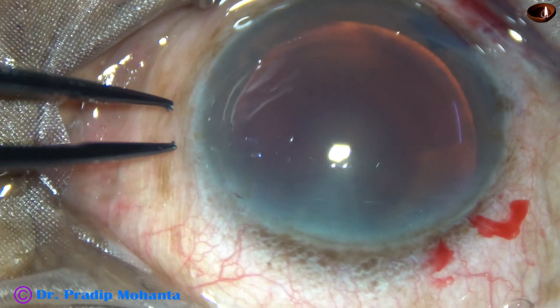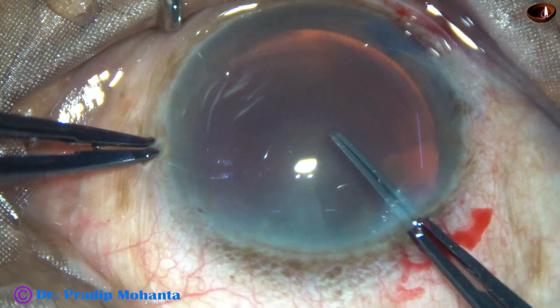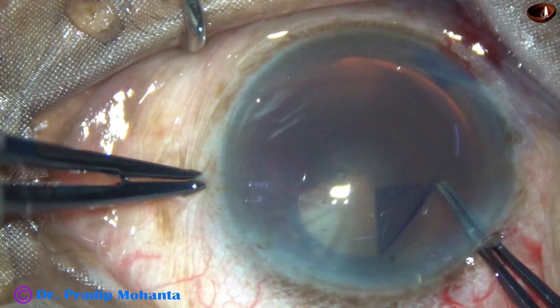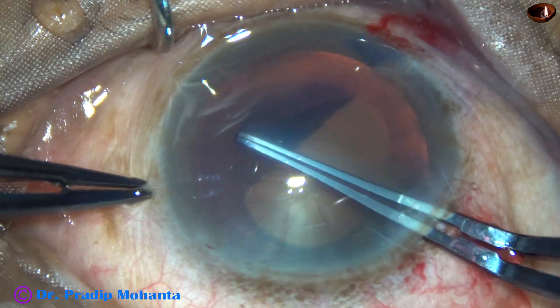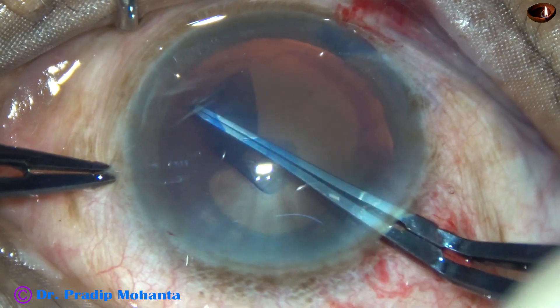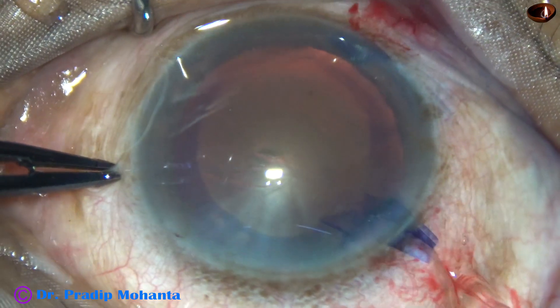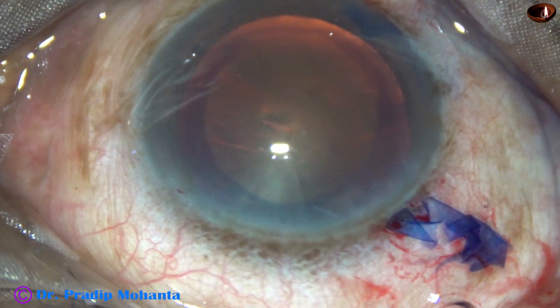It is going to be a large rhexis because you can see that the cataract is very hard. Nuclear sclerosis is at least grade 5. Now rhexis is being done with the help of these Utrata forceps. Here at 6 o'clock, the rhexis tended to go to the periphery but I could retrieve it in time. It has become a large oval rhexis.